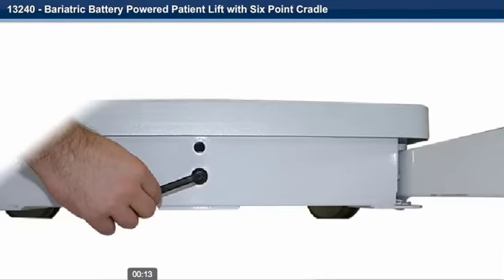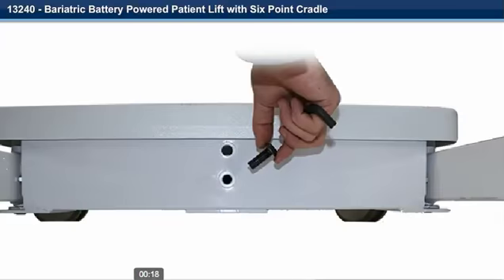Step 2. Remove the Allen head cap screw from the base of the unit with the provided Allen wrench.